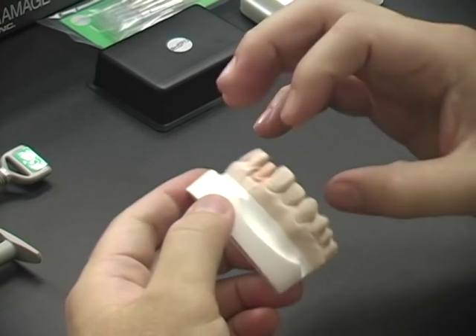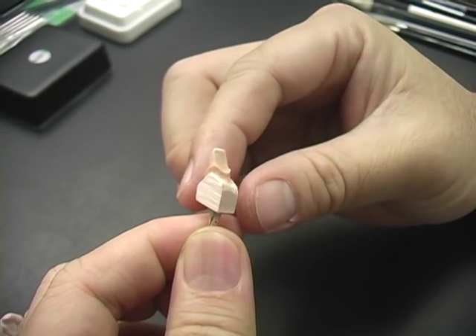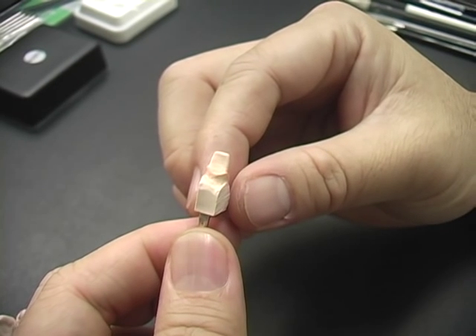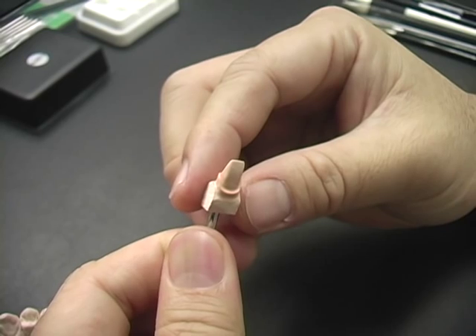Prepare the working model and separate the die. After removing the die from the tray, clean the surface and mark the margin with a red pencil. The prepared die is now ready for fabrication of a single crown.